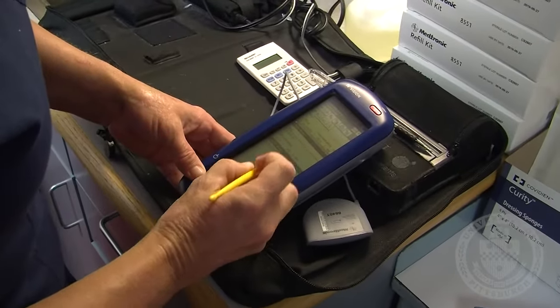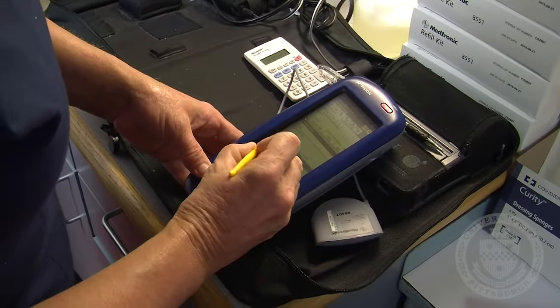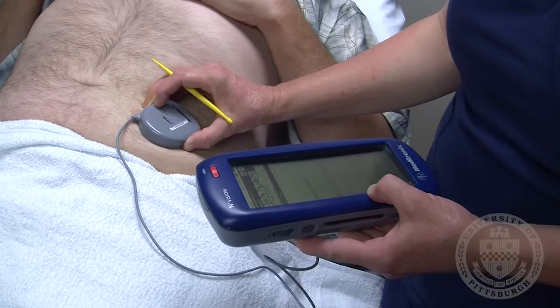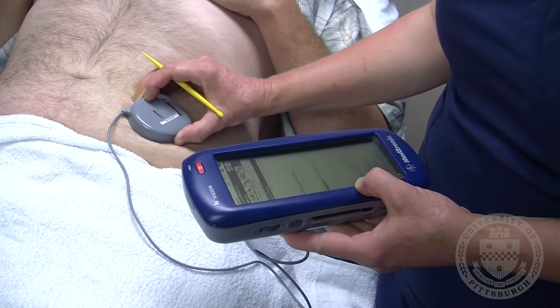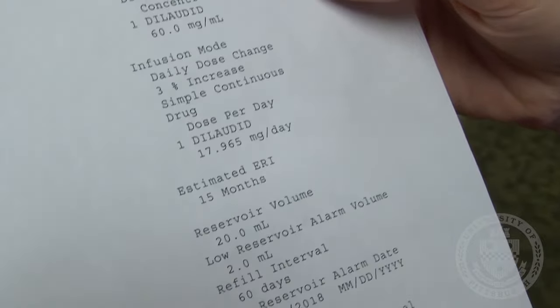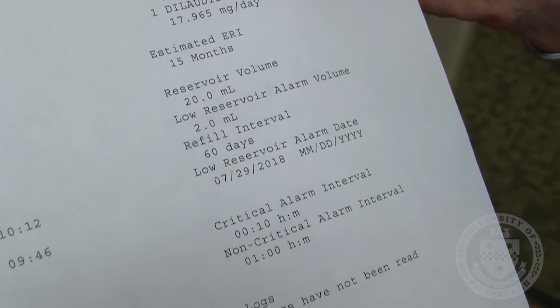The pump is reprogrammed to reflect the new quantity of medicine and any changes made to the dosage. Finally, you will receive a printout showing the new information and your new alarm date.